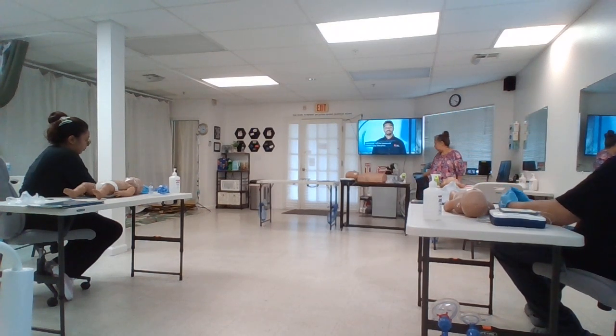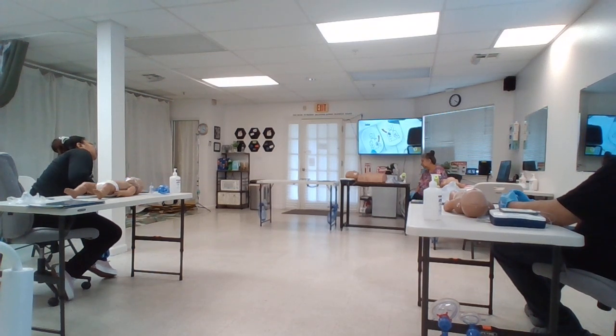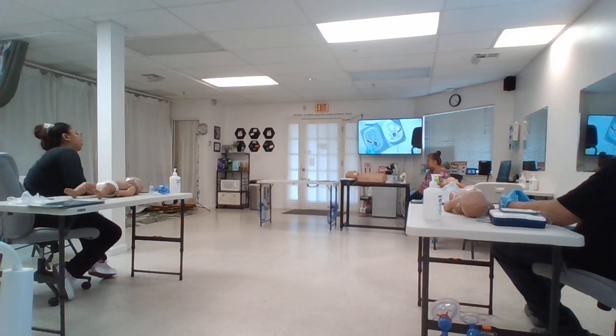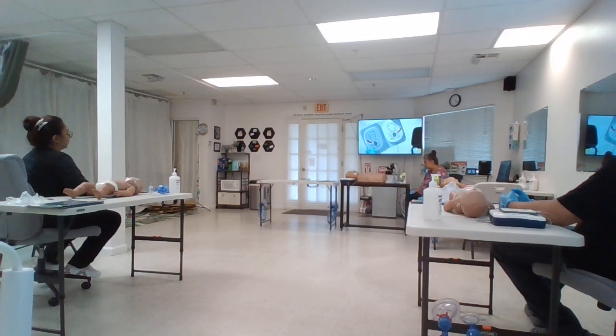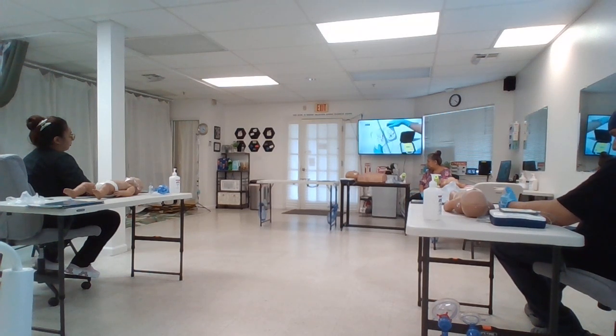There are some differences when you're using an AED for infants and children younger than 8 years old. Some AEDs can deliver either an adult shock dose or a child dose. A pediatric capable AED will have features that allow a child-appropriate shock, but the available features depend on the type of AED you're using. Your AED may also include smaller sized pads designed for children younger than 8 years of age. If it does, use them.